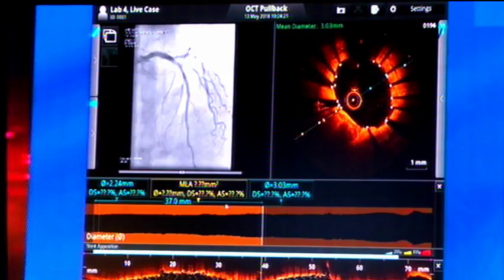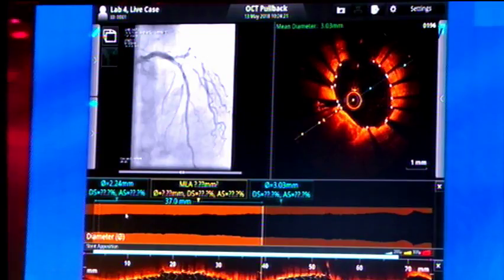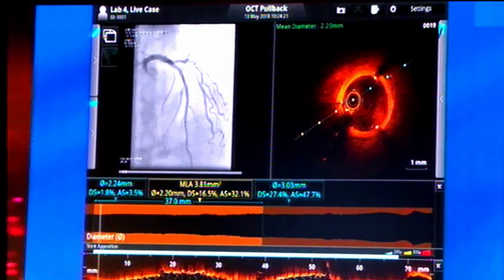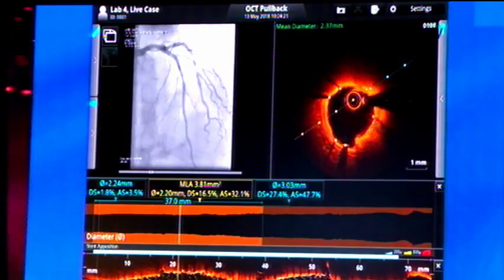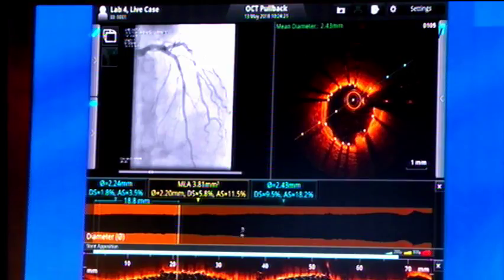What we're looking at here is the area stenosis. You see there's a question mark that's come up, and that's just because it hasn't liked some of the edge detection there. For the principle of time, I'm just going to accept that. It's telling me now the area stenosis is 32%. For Illumien 3, we were looking at less than 10%. So I want to divide the stent in half, because that's what we were doing in Illumien 3. We've got 18 millimeters there, with an area stenosis of 11%. I'm very happy with that.